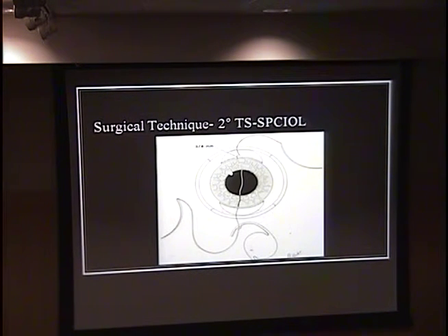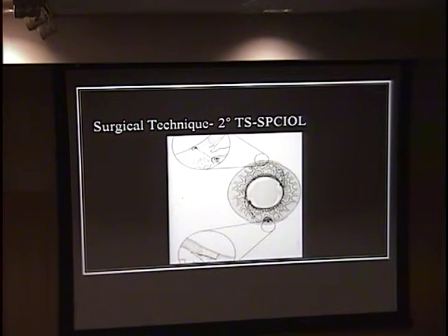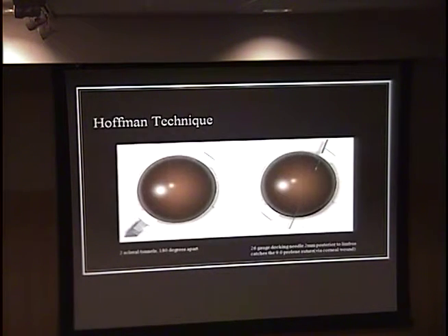And this is basically showing the same thing. This is kind of going under the pupil and out of the eye. And then once you pass the other one the same way, that will be secure. And that's kind of what you end up with.